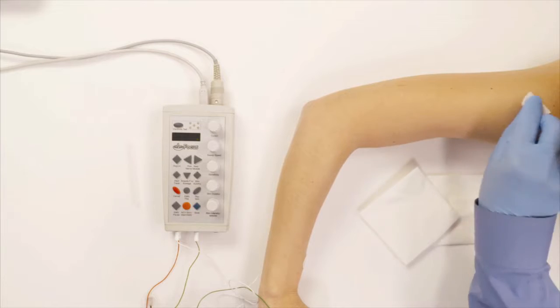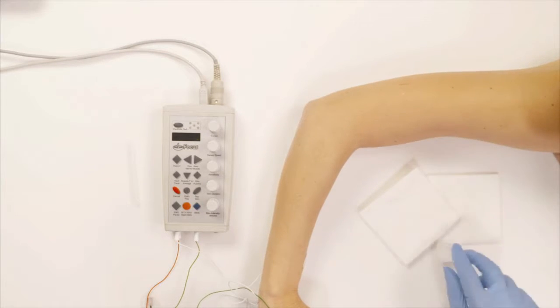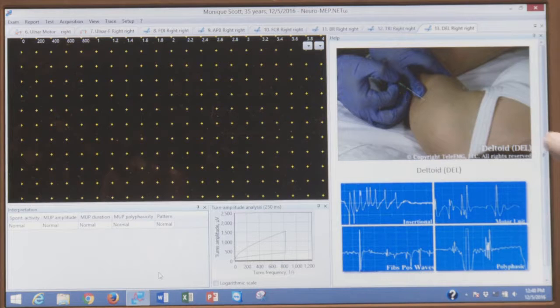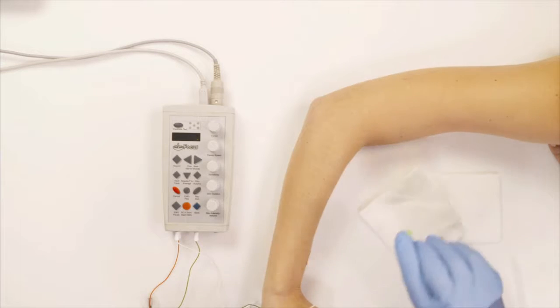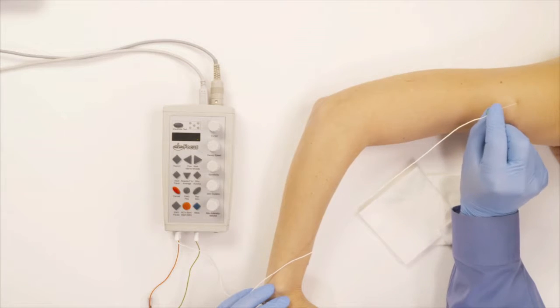So I'm gonna wipe it and you see where the deltoid is right by the shoulder muscle and that's exactly where I'm gonna stick the needle. I'm gonna do the stick here, here we go.